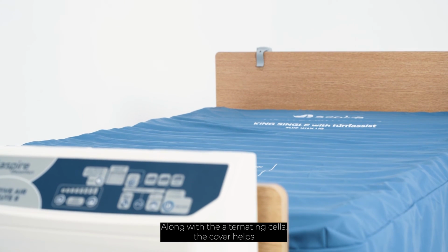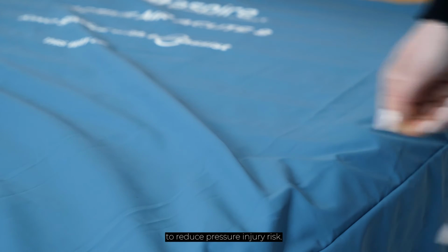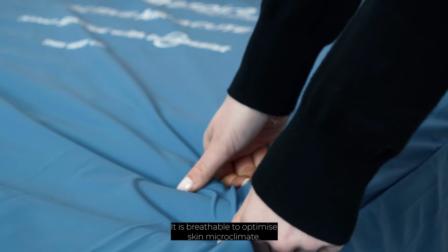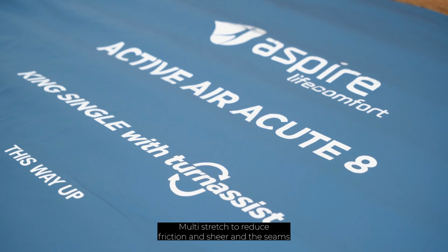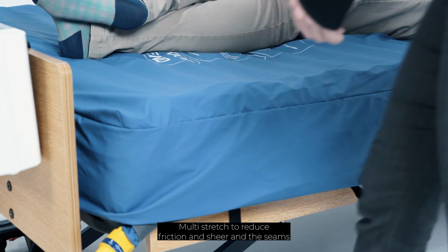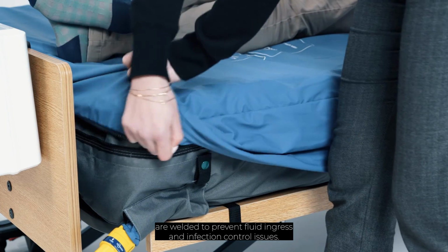Along with the alternating cells, the cover helps to reduce pressure injury risk. It is breathable to optimise skin microclimate, multi-stretch to reduce friction and shear, and the seams are welded to prevent fluid ingress and infection control issues.